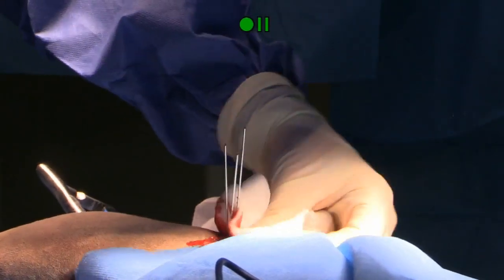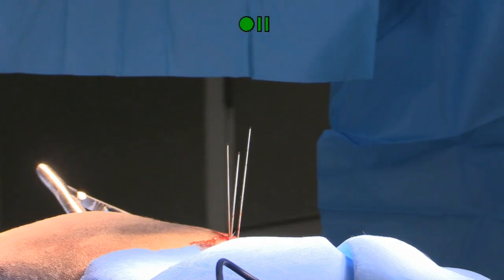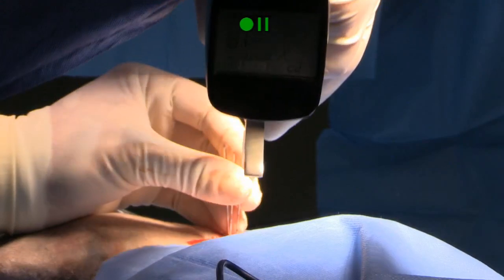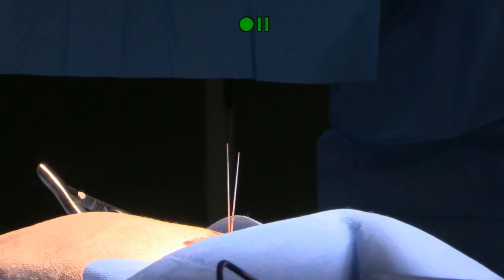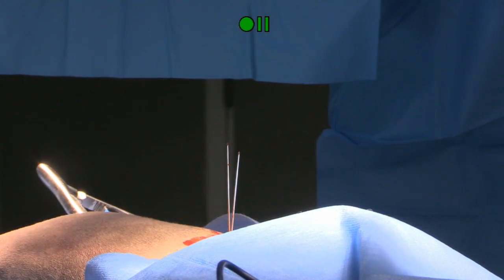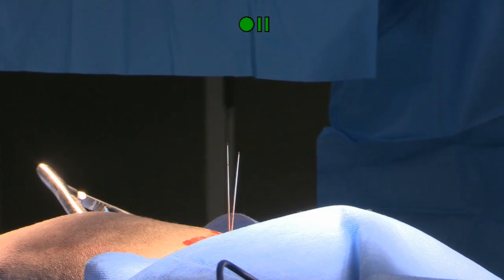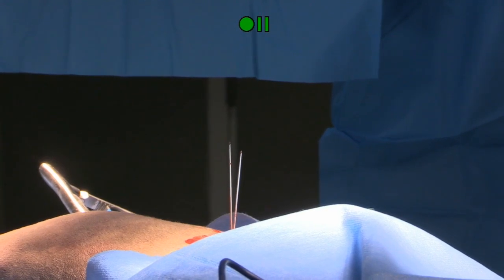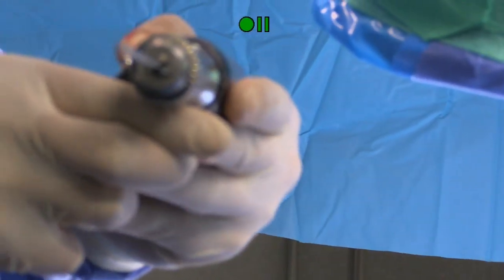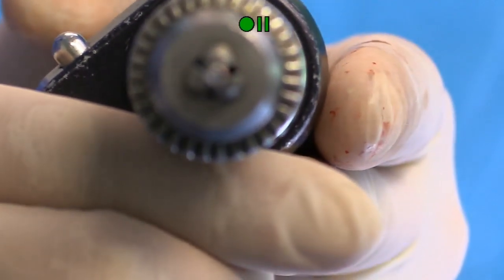So here comes the drill bit that's going to go right over. Or not. Sorry. It's going to take this one out. Getting the other pins out of the way. So do you want to show the end of that drill bit, Jane? See if I can zoom in on that. That's right, you can just hold it still. Come back out a little bit.